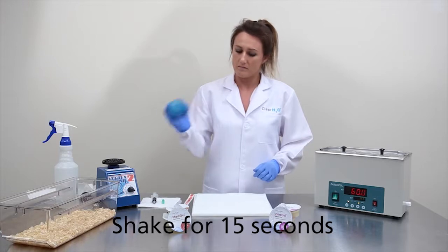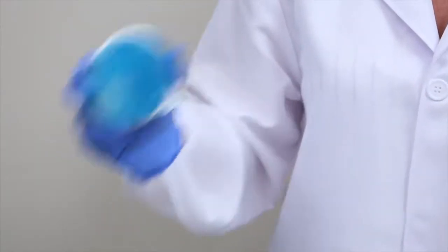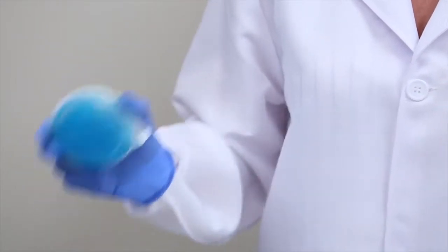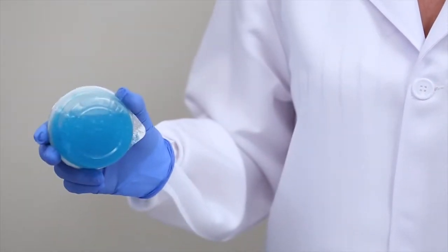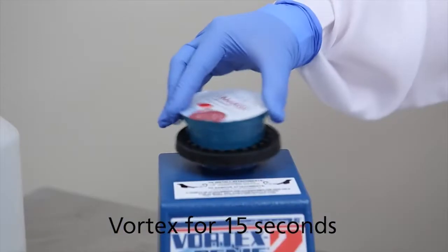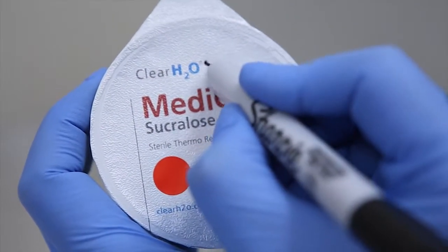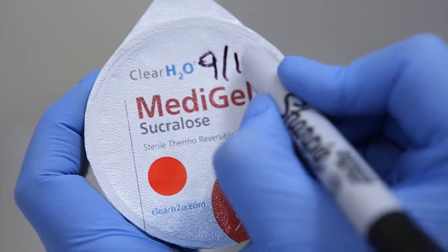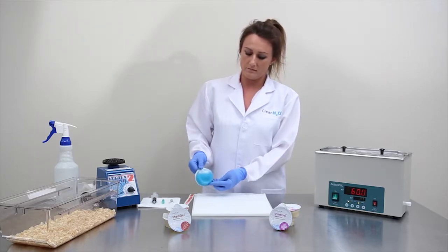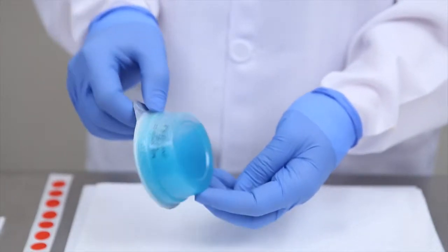Now the cup is ready to shake by hand for a count of 15 seconds. For this demonstration, we have added blue food coloring to the medication as a visual aid to show thorough homogeneous mixing. Vortex for an additional count of 15 seconds. Once complete, write the date on the cup lid to aid in tracking and inventory management. As you can see by the blue food coloring, the medication is thoroughly mixed throughout the MetaGel Sucralose.